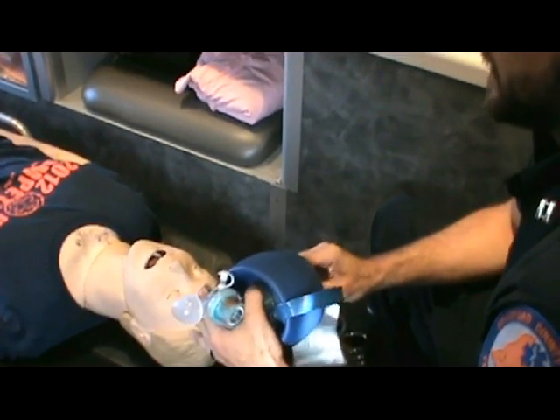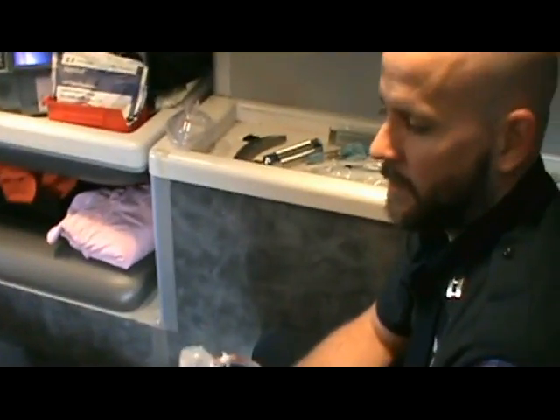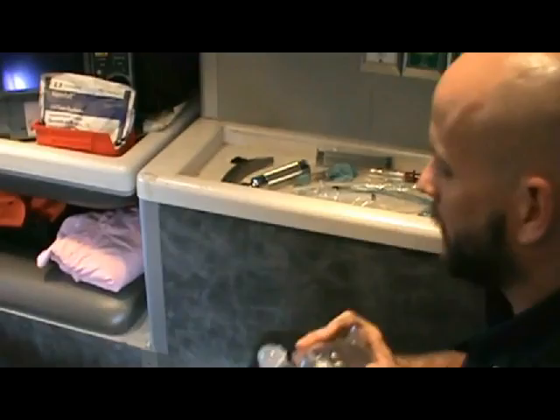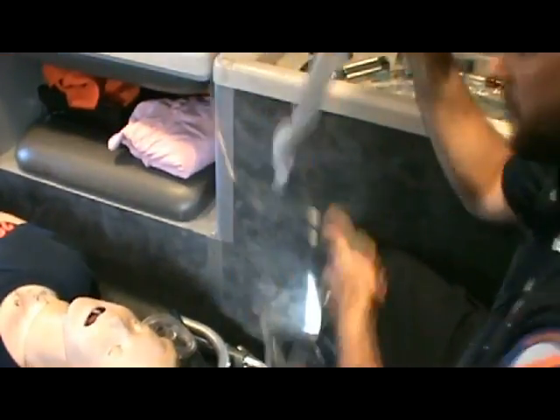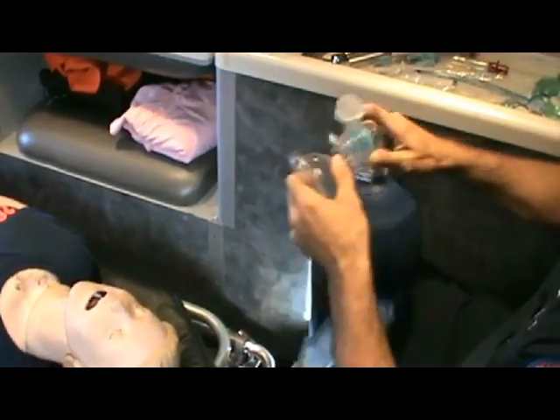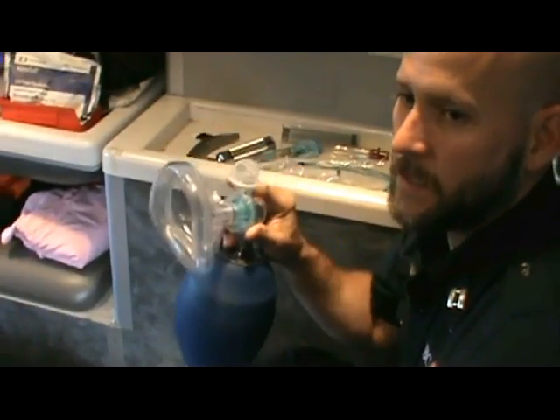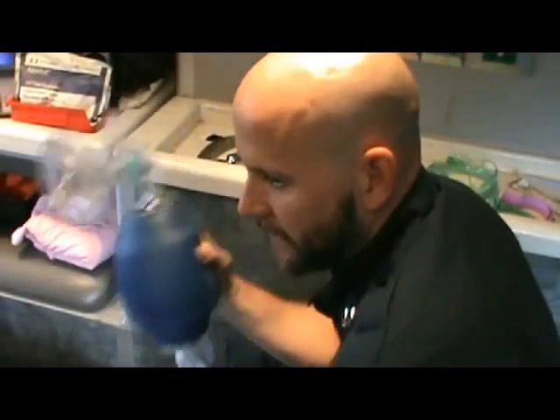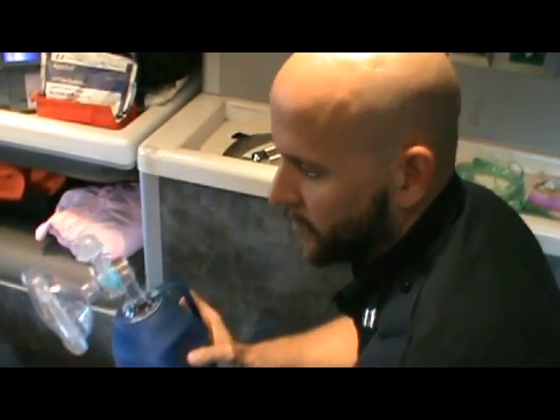To start off, before we even start squeezing the bag, let's talk about how to place it on the patient. What we all do is pull it out of the bag, open it up, plug it into oxygen, and assemble it away from the patient. This is a mistake if you have more people on scene. Please do two-person BVM versus single-person BVM whenever at all possible.